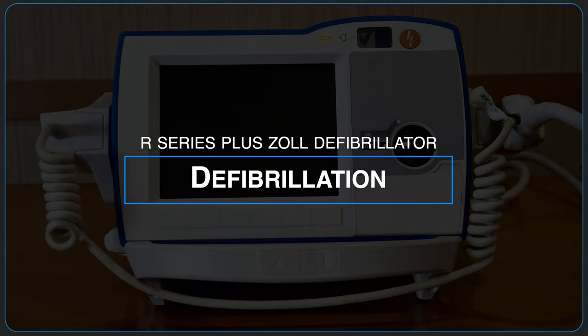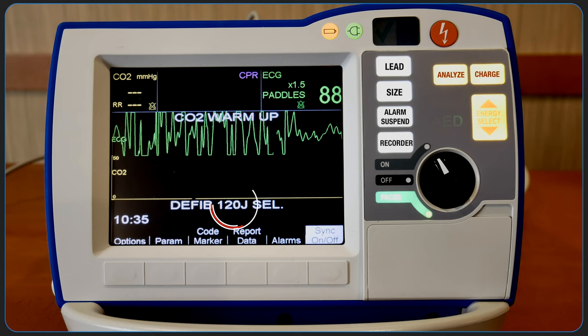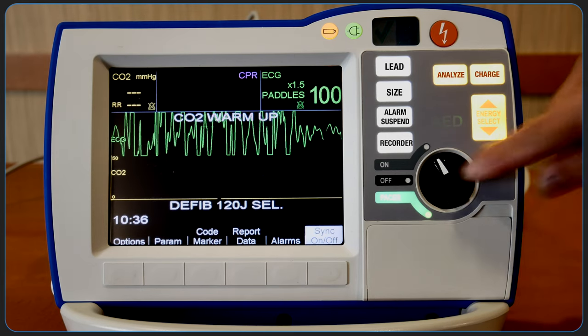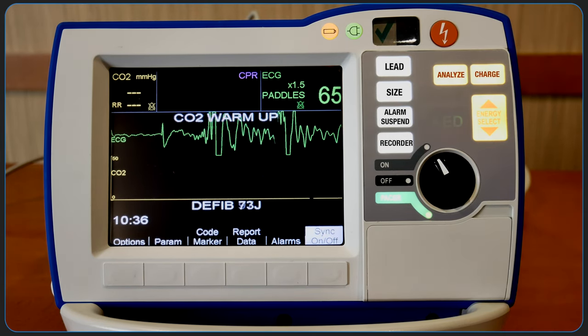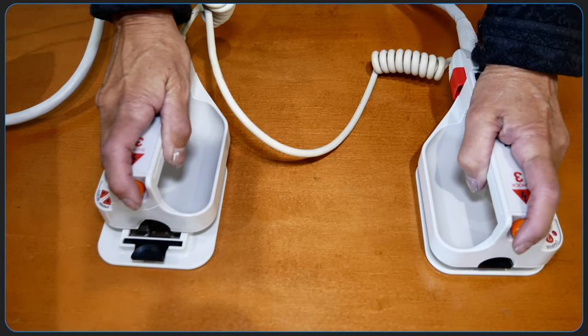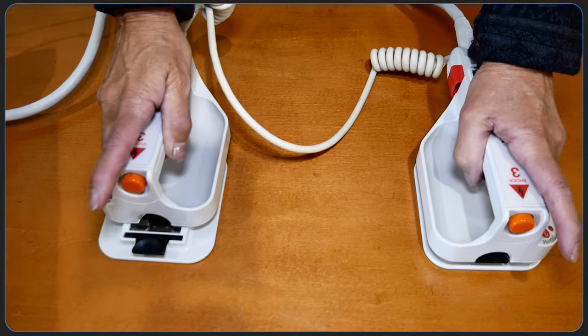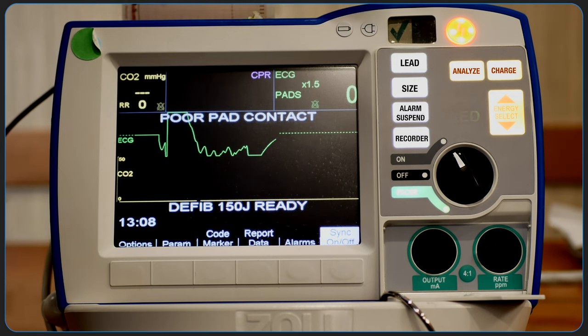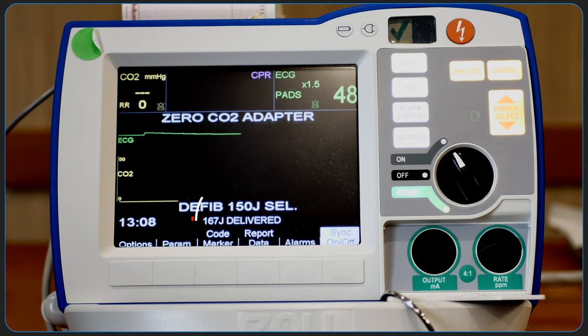To use the defibrillator, look on the display and verify that the energy is appropriate. The default energy selections are 120, 150, and 200. Press charge on the apex handle of the paddle or on the front panel as demonstrated here. To deliver the shock with external paddles, press and hold both shock buttons simultaneously while applying a force of 10 to 12 kilograms to each paddle. To deliver the shock with electrode pads, press the shock button on the front display.